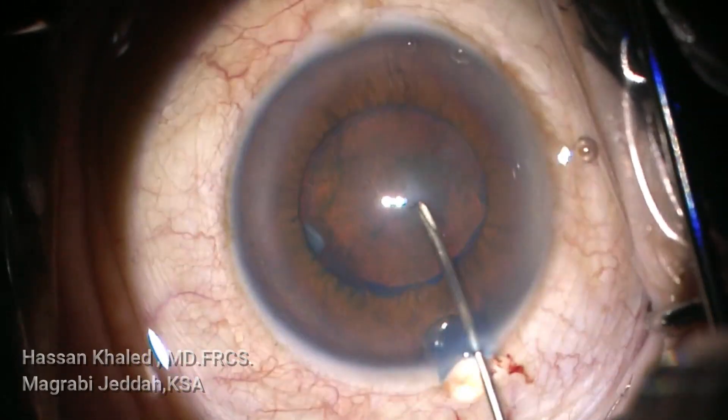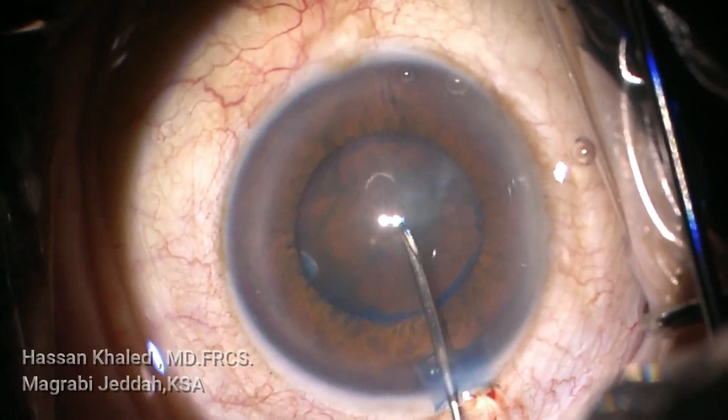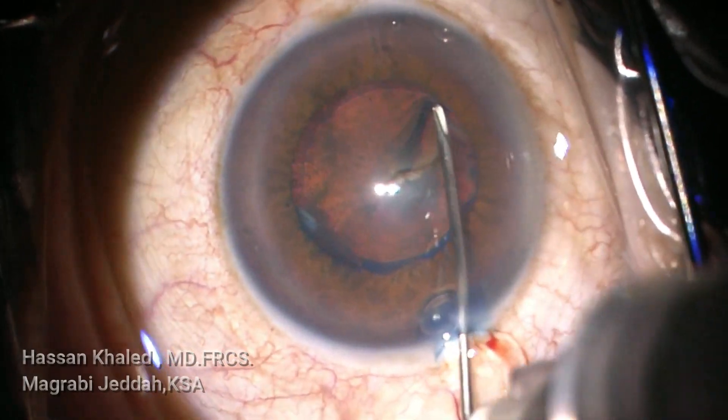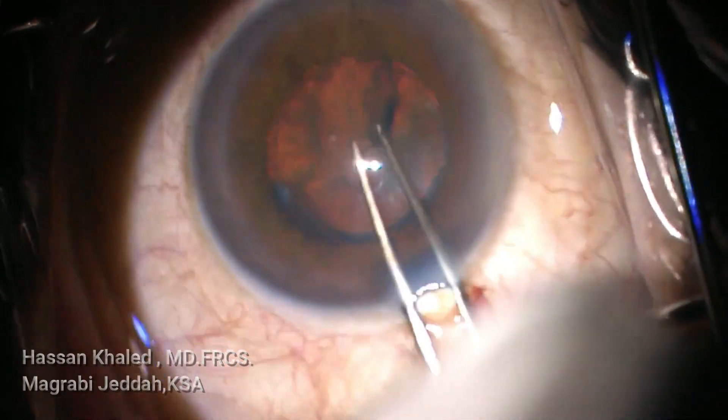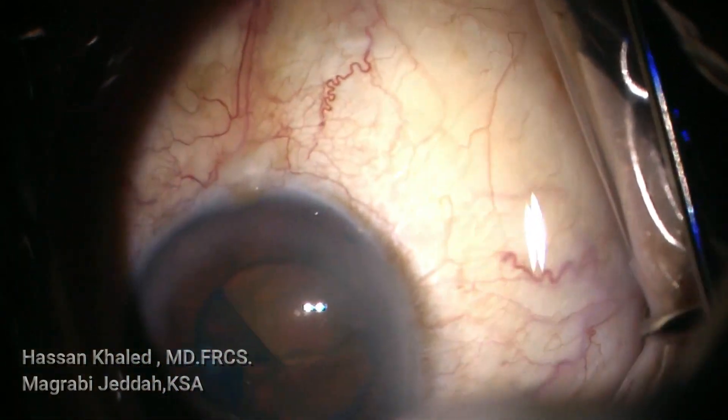Starting the surgery with a 2.2mm clear corneal incision, then staining the anterior capsule. You can see the weakness of the zonule before initiating the anterior capsular flap to start the capsular rhexis.